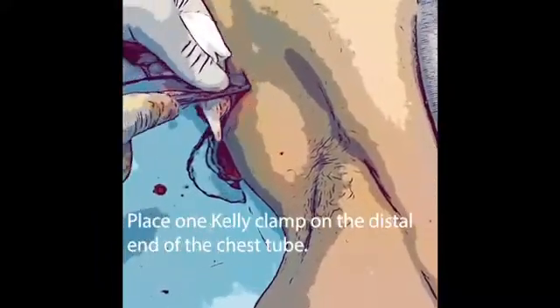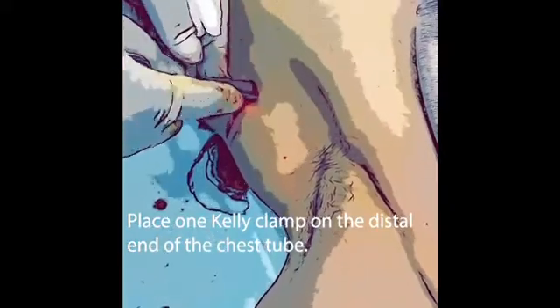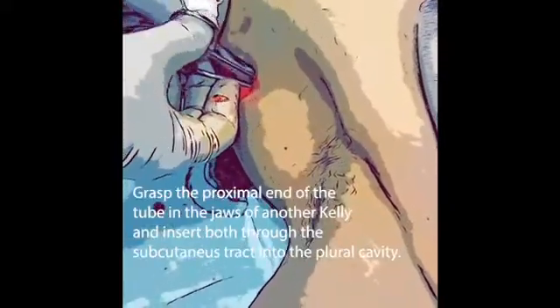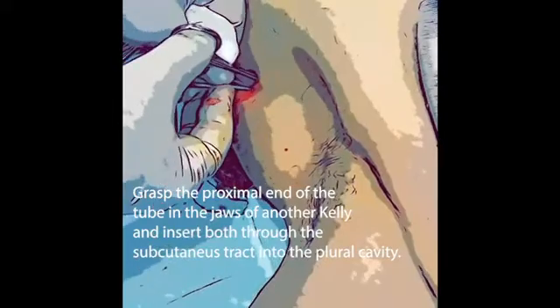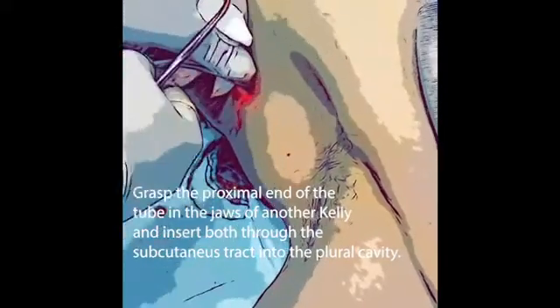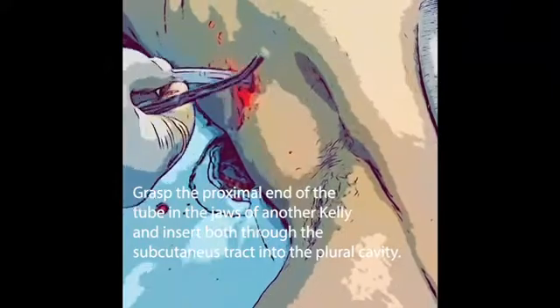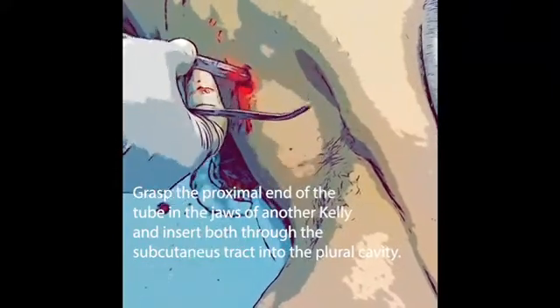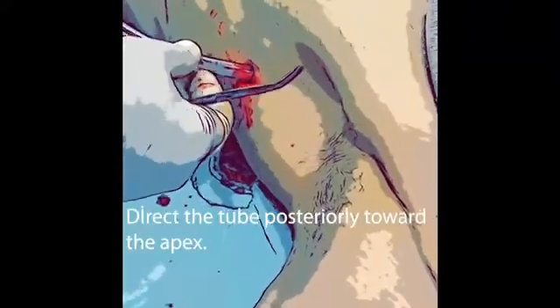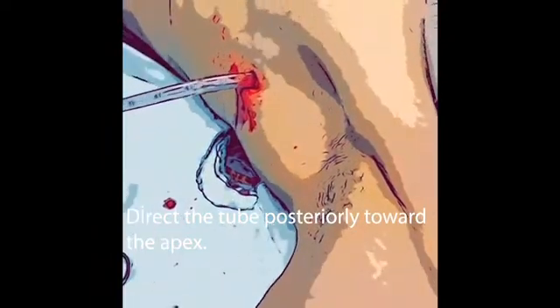Place one kelly clamp on the distal end of the chest tube. Grasp the proximal end of the tube in the jaws of another kelly and insert both through the subcutaneous tract into the pleural cavity. Direct the tube posteriorly toward the apex.